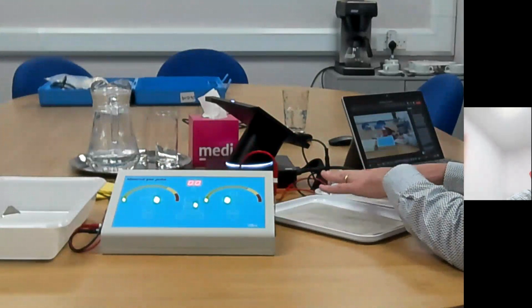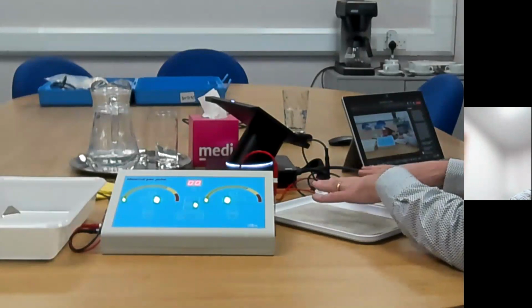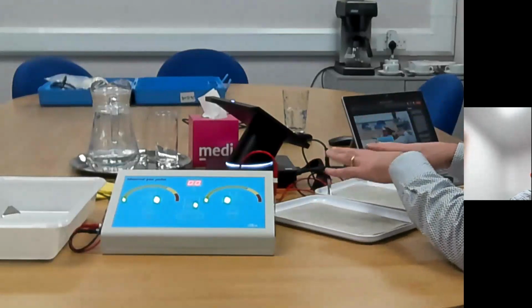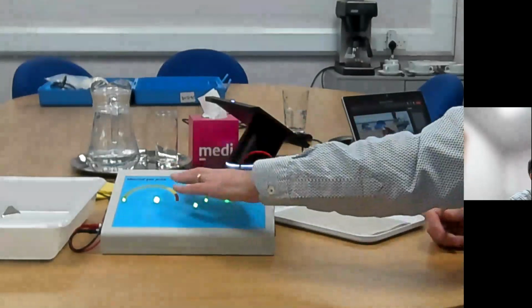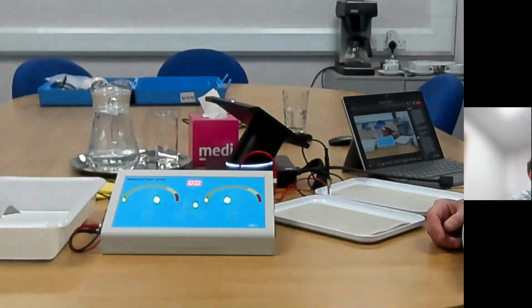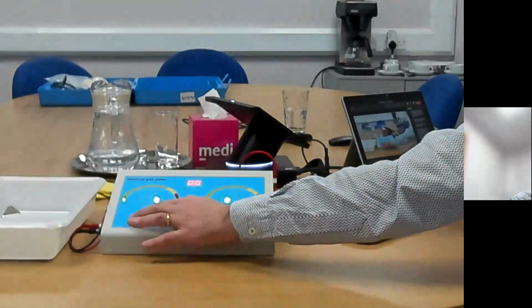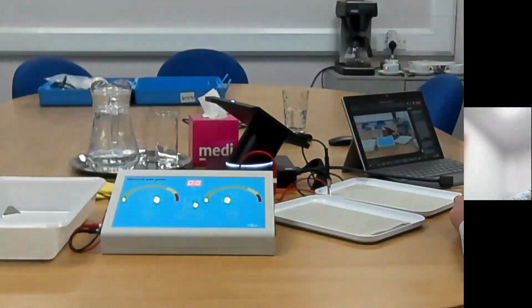It's often the case that once you reverse the polarity, the patients can tolerate either more or less than they could in the first polarity, and that's usually down to whichever their dominant hand is, because the skin is slightly thicker or different on the dominant hand to the non-dominant hand. So don't worry if they could tolerate 5 milliamps in one way and 7 the other way, or vice versa. That's perfectly normal. Once you've reached a further 10 minutes of treatment, you reduce the current down to 0, let them take their hands out. That's the treatment session completed.